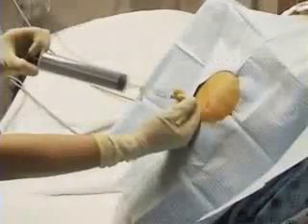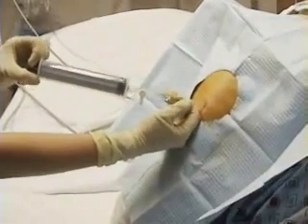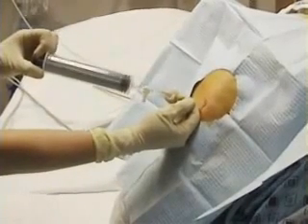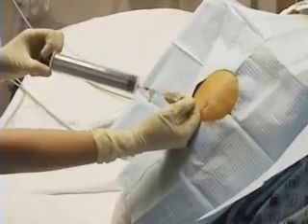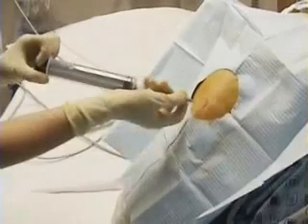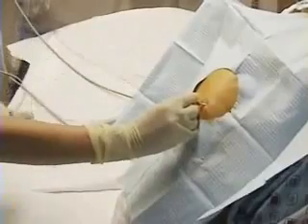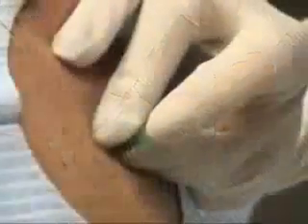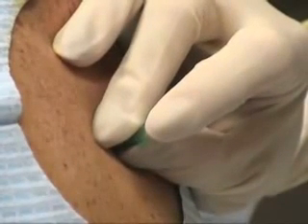Attach an 18-gauge over-the-needle catheter to a syringe and advance it along the superior surface of the rib. Keep pulling back on the plunger as you proceed to the predetermined depth of the pleural space. Once fluid is aspirated, immediately stop advancing the needle and guide the plastic catheter over the needle. When the catheter is fully inserted, remove the needle as the patient exhales or hums. The exposed hub of the catheter should be covered immediately with your finger to prevent the entry of air into the pleural space.